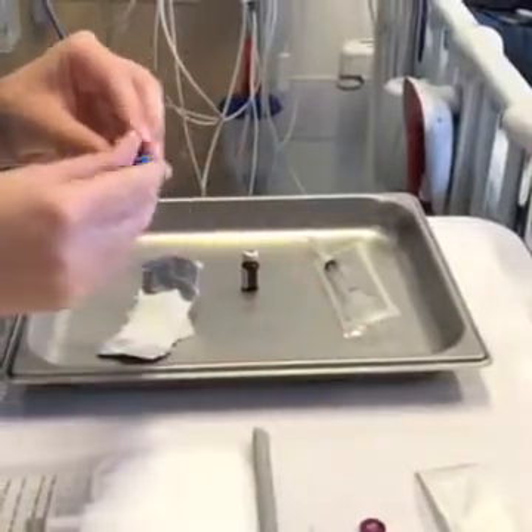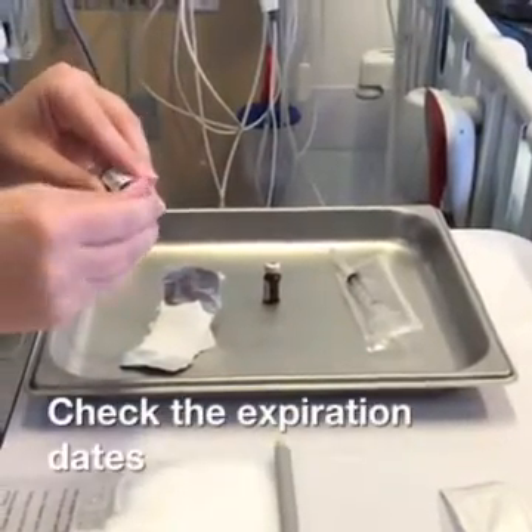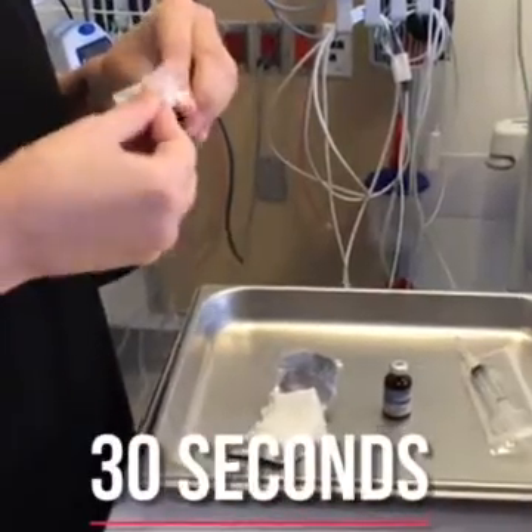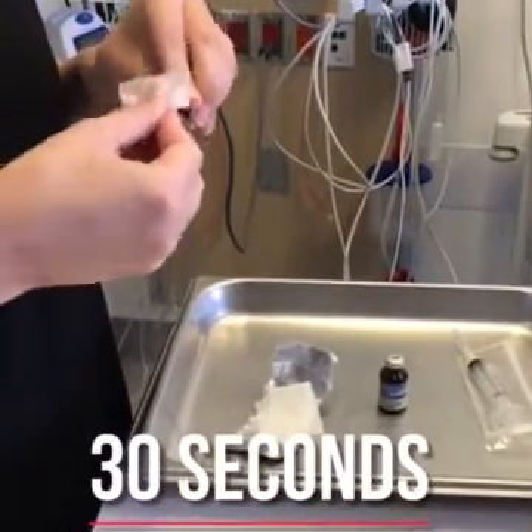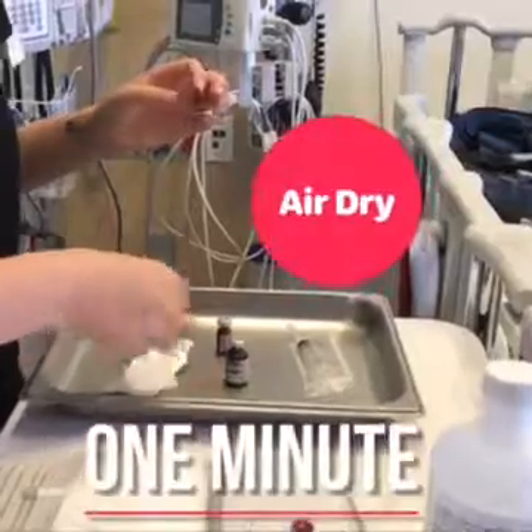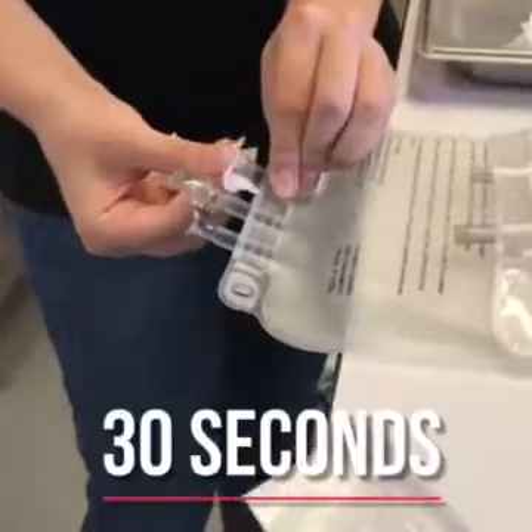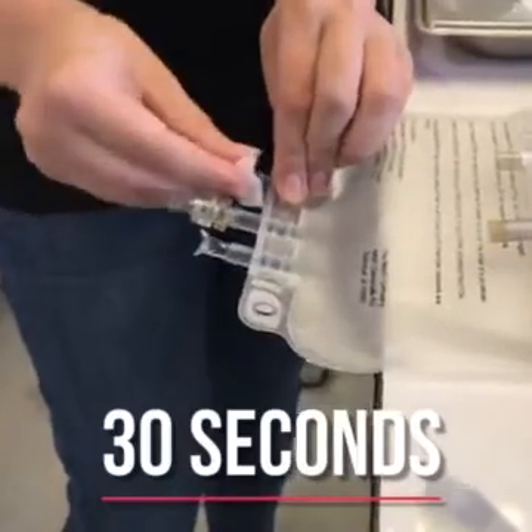Check the expiration dates on the medications you're adding. Scrub each vitamin bottle top for 30 seconds with an alcohol swab, then allow the tops to air dry for one minute.